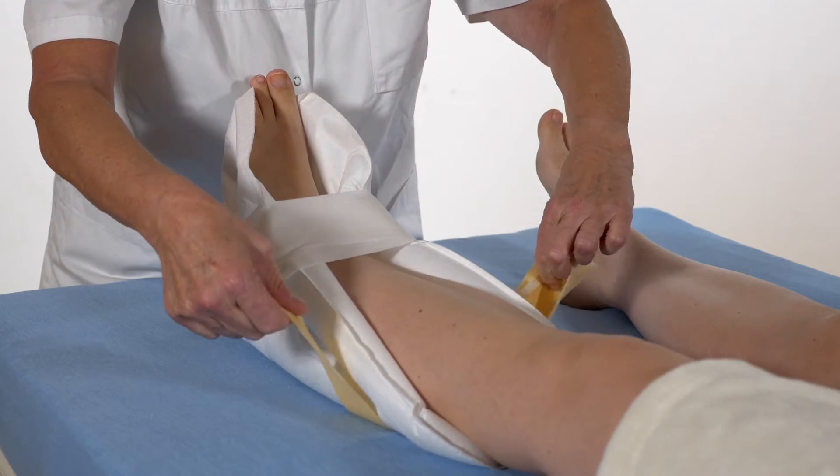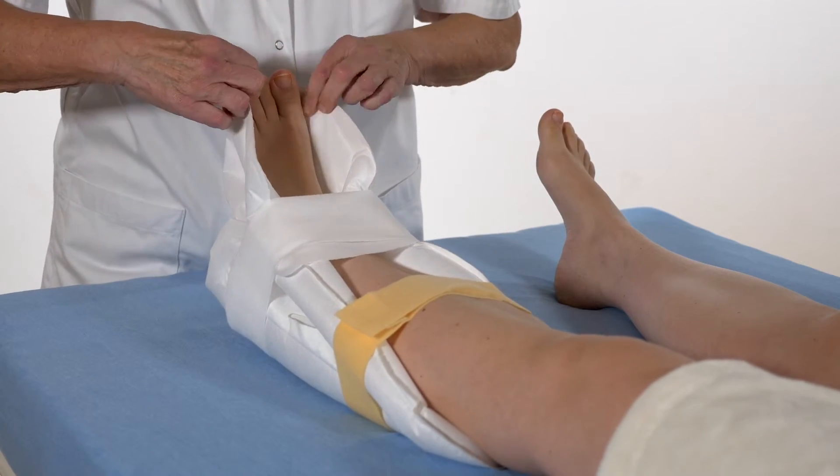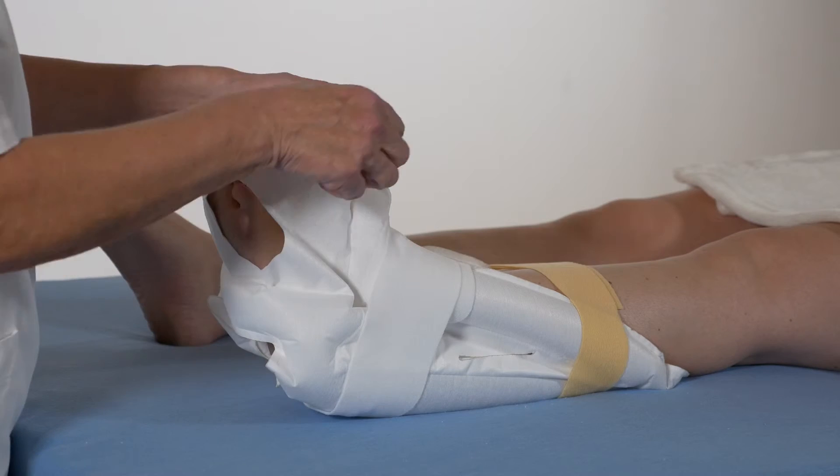Remember to check the lifting height at least once a day. If additional fixation of the cushion is needed, you can use the colored ribbon supplied.